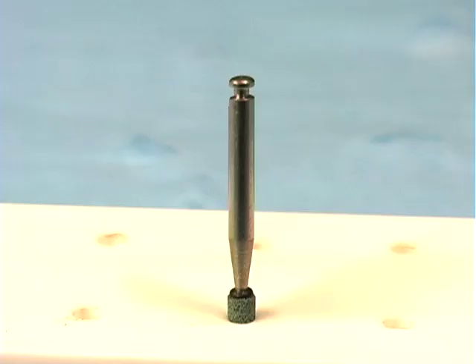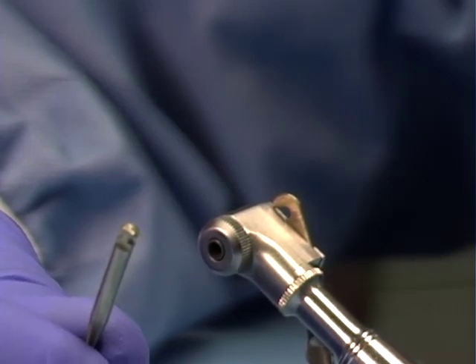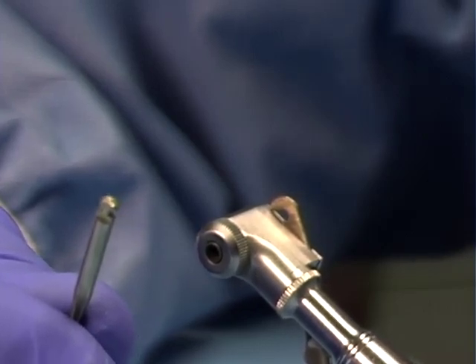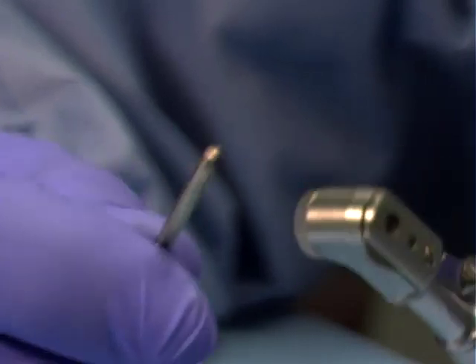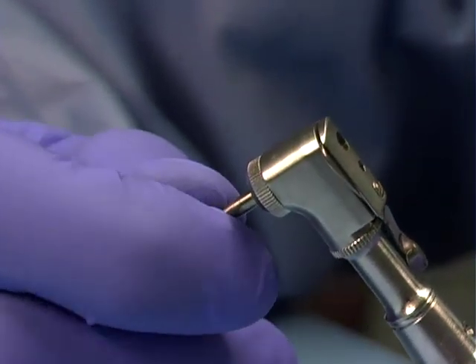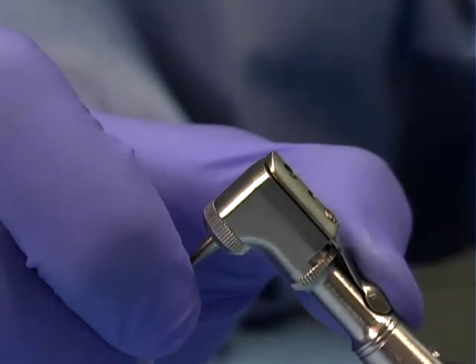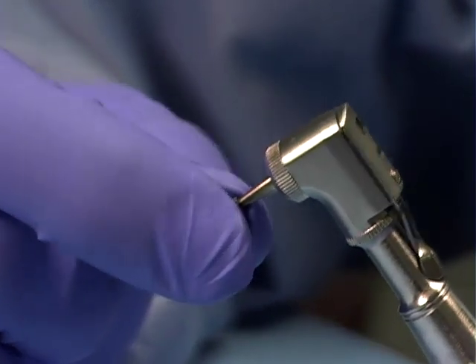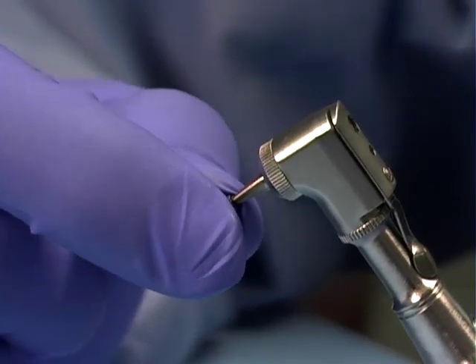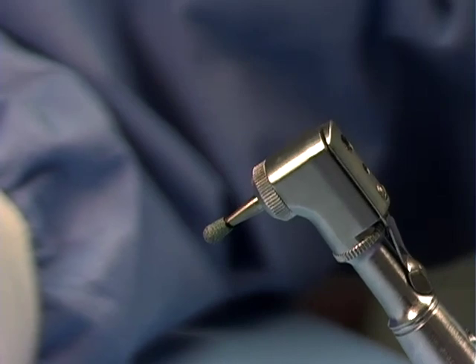The burrs we use are latch type. Latch type burrs require a contra-angle attachment on the slow speed handpiece. Place the burr in the contra-angle and twist until it is fully seated. Close the latch to hold the burr, then tug on the burr end to ensure it is held fully in place. This is to ensure that the burr does not come out in the patient's mouth while working.